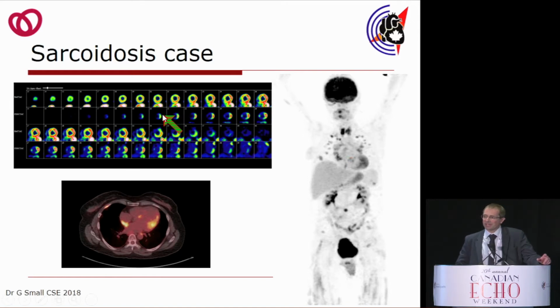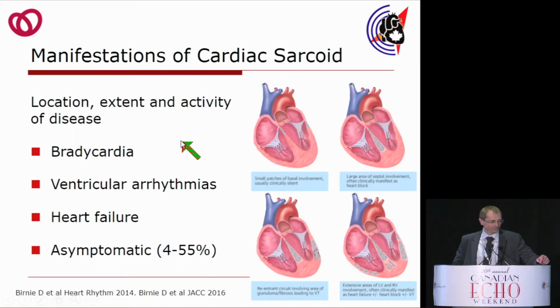What we do when we obtain these images, we then discuss the case with nuclear medicine, whose role here is to report the whole body images, and our role is to report the cardiac images. And then we make sure that there's consistency between the two reports.